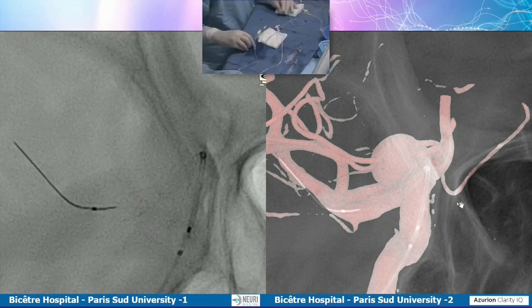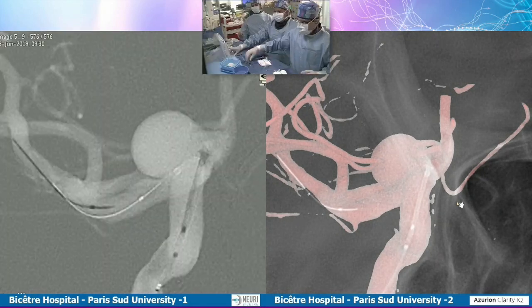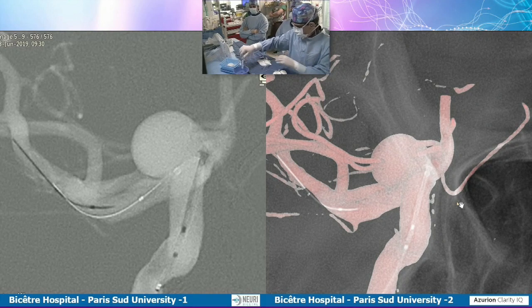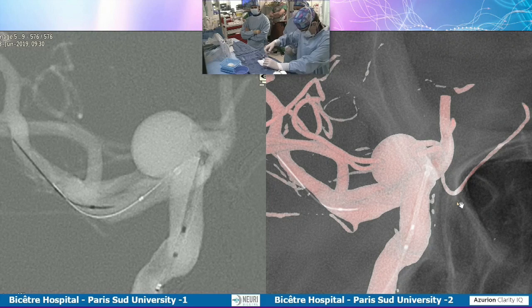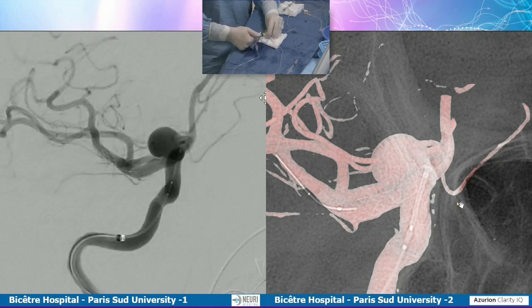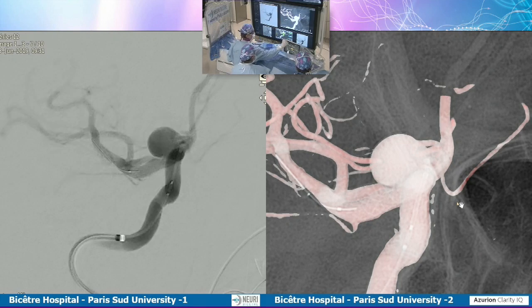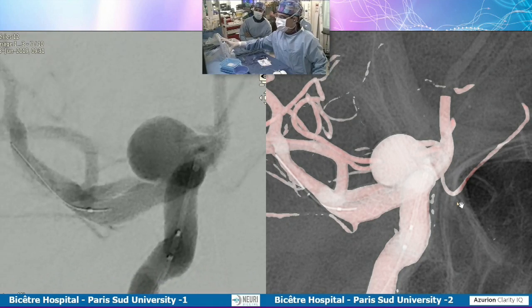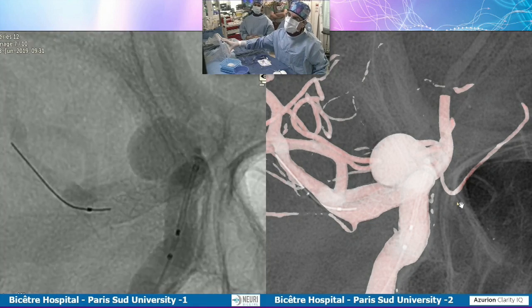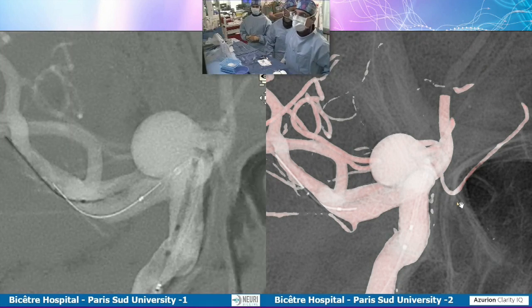Does the presence of intrasaccular thrombosis change your choice to coil or not? The answer for us is no. It doesn't change the concern, except if it's a real giant partially thrombosed aneurysm. Giant, partially thrombosed or not, we definitely prefer to coil in 1 or 2 sessions and then put a flow diverter, because we have a lot of risk to lose the control of the proteolytic enzyme release and the vasa vasorum and then to get bleeding of the aneurysm.